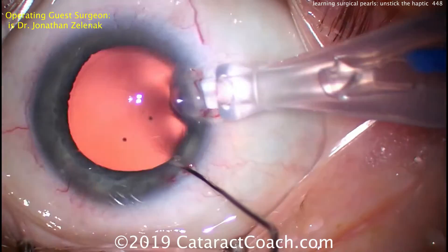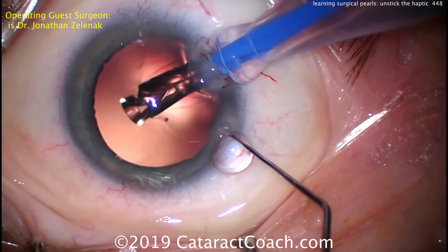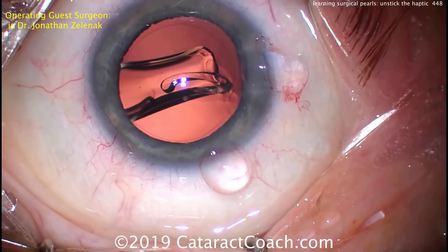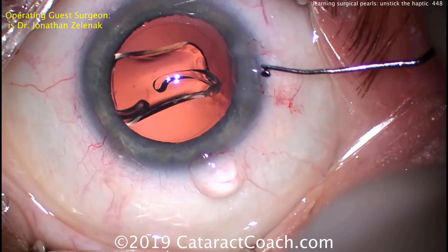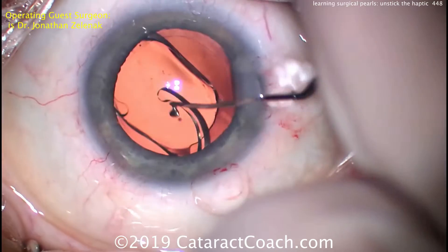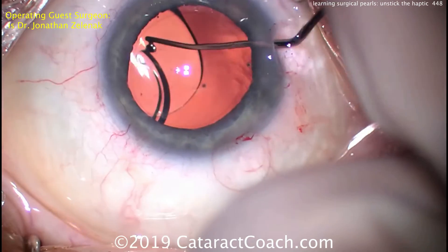Other options: people can also use capsulorhexis forceps and literally just pinch or deform that stuck haptic, and then it won't stick as much. Here, delivering the lens — as it goes into the eye it's unfolding nicely, and then the second instrument goes underneath that haptic and the haptic is lifted up towards the corneal apex, and that works great.